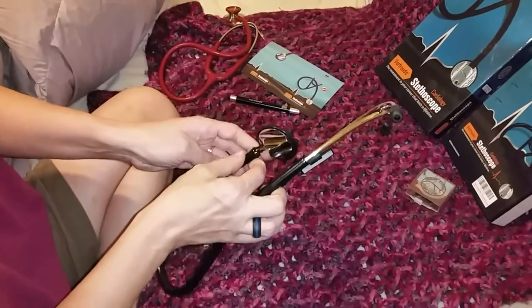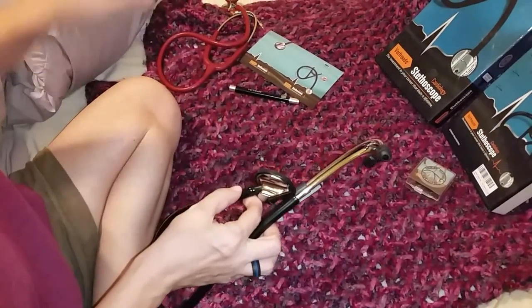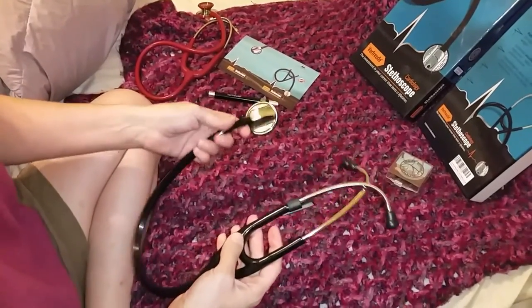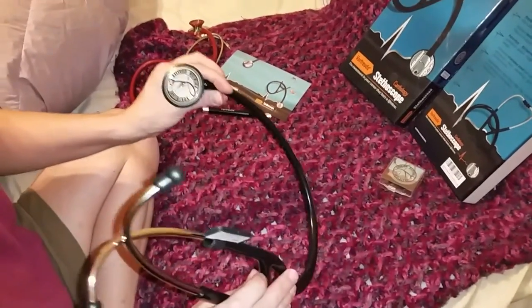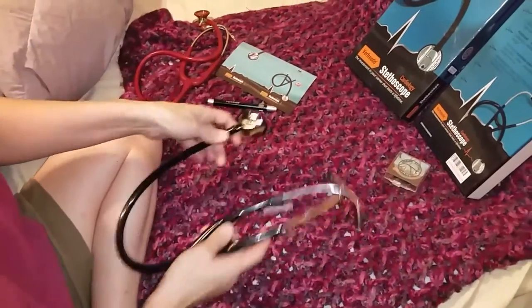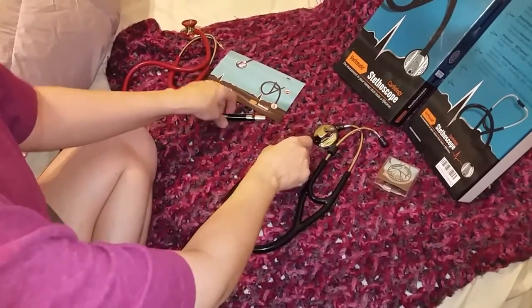You no longer have to worry about picking up everything in the room. So if you're looking for a really good stethoscope, you've got one here — even if it's not for a dog. This is good stuff.